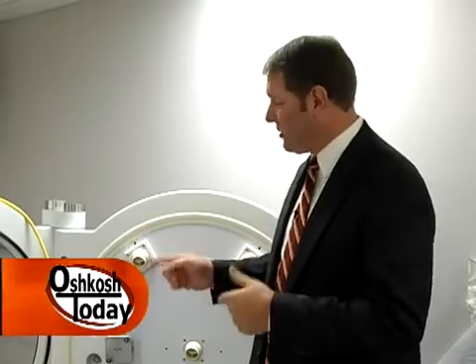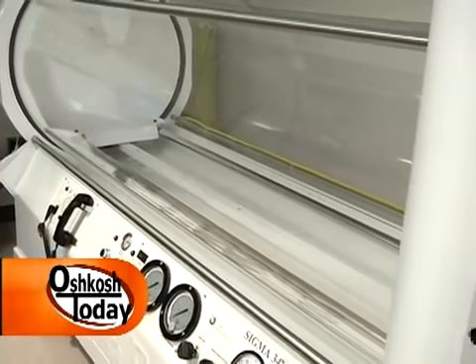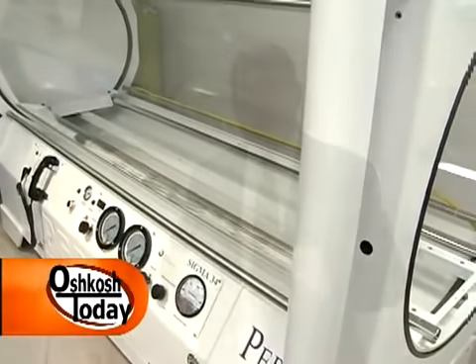Hello and welcome to another edition of Focus on Health. I'm Ted Stefaniak. Today we're going inside a hyperbaric oxygen chamber here at Aurora Medical Center in Oshkosh. Now when you think of a unit like this, a lot of times you're thinking about divers that have gone too deep in the water and maybe they get the bends, but did you know that a unit like this could also help you with wounds, burns, and even help you with radiation exposure?